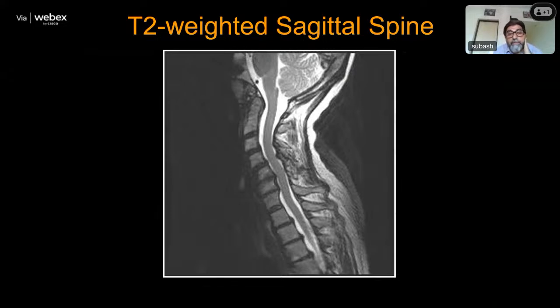And if you do an MRI of a spondylitic patient, you can see the images will look like this. The disc and the vertebra will be pressing the spinal cord, which is called compression of the nerves, and the person gets pain or numbness in the upper limbs.